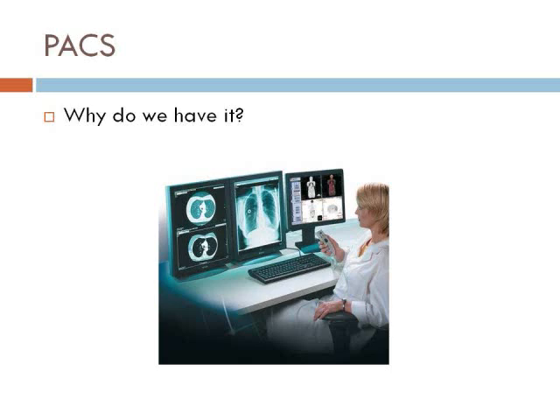As soon as the image is uploaded to the PACS system, the radiologist is able to view it and interpret the results, and they are even able to document their findings, which they usually would do as audio dictation or typed on the PACS system, and everybody has access to be able to see that.